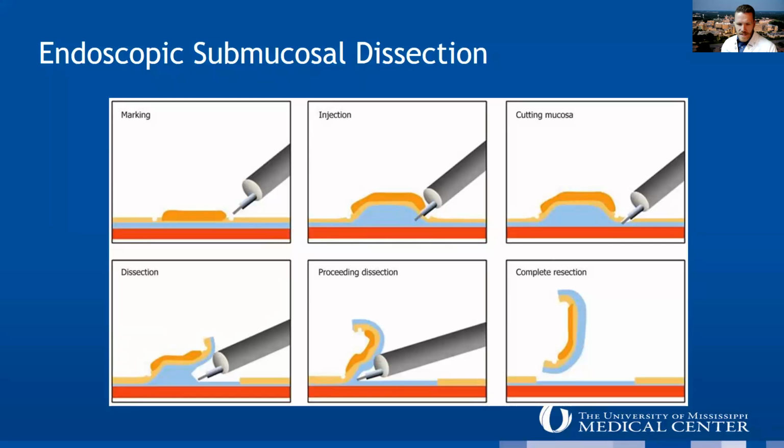So that leads to the introduction of ESD, or endoscopic submucosal dissection, something that we've begun practicing here, that's going to give you an opportunity for an en-bloc resection of those larger lesions. This is just a cartoon schematic, and we'll look at a video in a second, but in essence, we're going to be lifting, tunneling, and completely resecting a lesion.